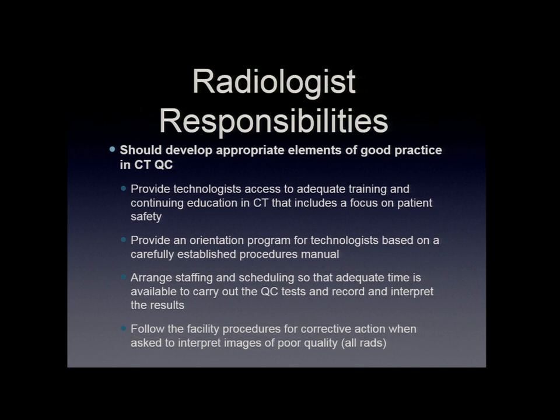You have to make sure that not only are they just an RT, but they have adequate training in CT specific modalities, and that they're familiar with all of the dose parameters and what they mean, and what the different effects of the protocol parameters are, how that will affect dose and how it will affect image quality. So that's now become more of a requirement, to make sure the technologists are current with that type of education, so that it's focusing on patient safety.